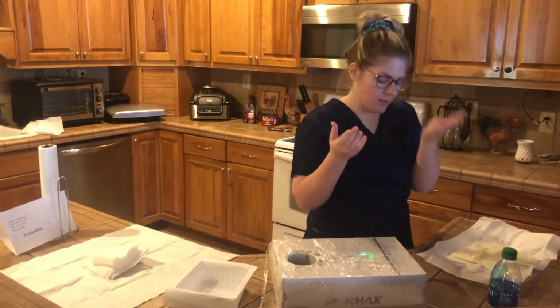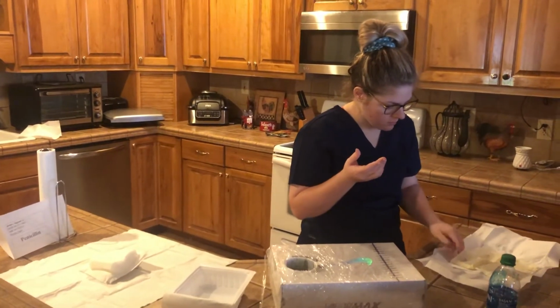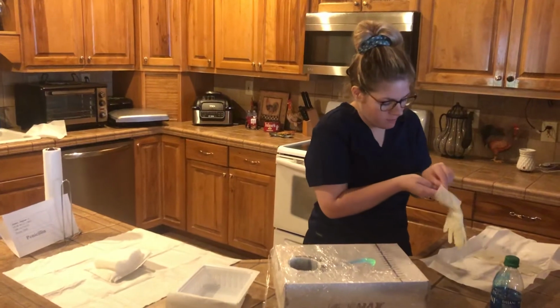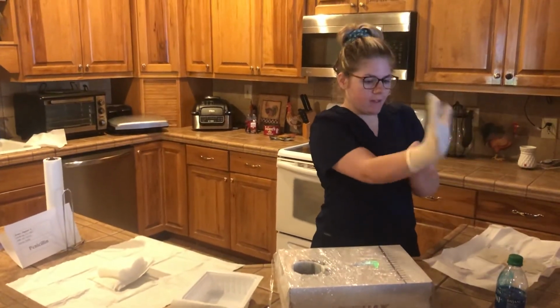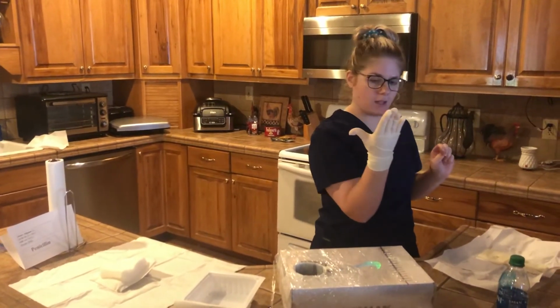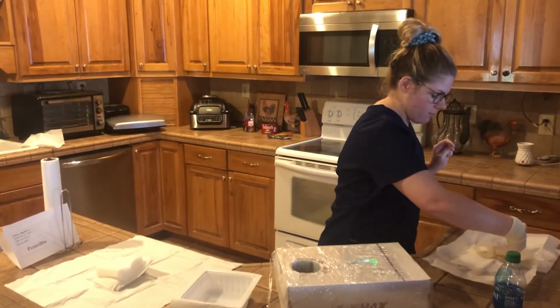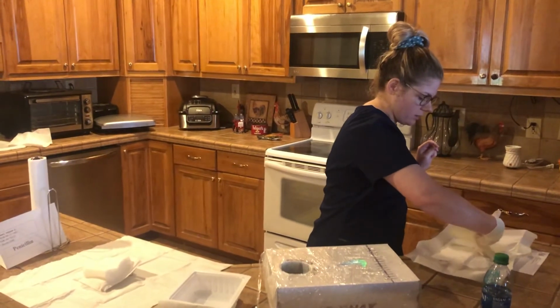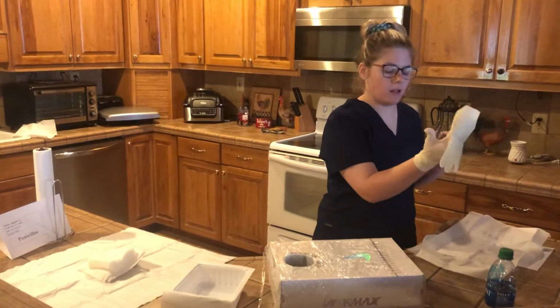With my hand like this, I will pick it up from the inside of the cup and slide my finger in. Now with my thumb sticking out and my fingers like this, I will go on the inside of this cup, making sure not to touch any non-sterile. Go like this.